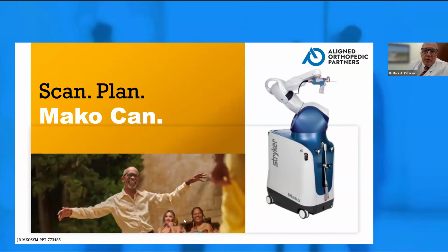So what does robotic surgery do? Well, robotic surgery, I think, is very accurate and very patient specific. It starts out by getting a CAT scan of the individual patient, and then we can put the implant in somebody's knee prior to doing any surgery. So that workup is done prior to the day of surgery. And then in surgery, we do some manipulations with the knee, stress the ligaments, and balance the knee so we can rotate the implant to specifically fit each patient individually.